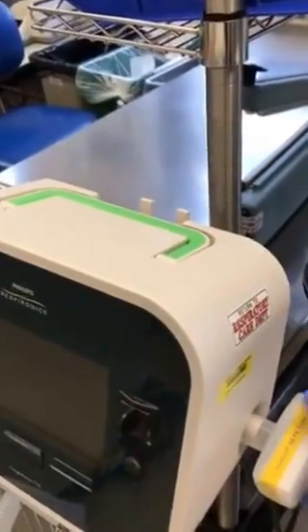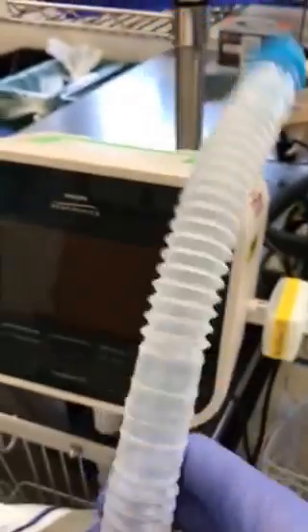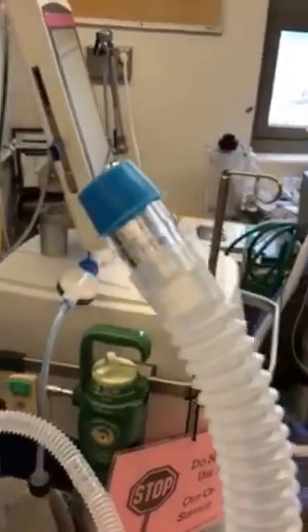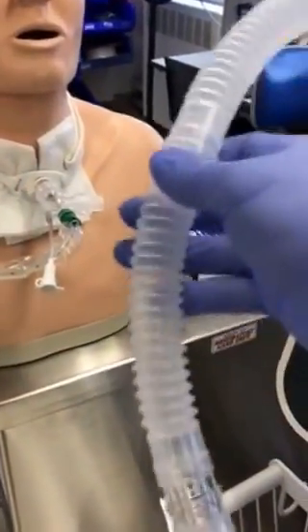You want to make sure the MIE machine always has a HEPA filter attached to it, and tubing not too long but enough. What I like to suggest is adding a 15 millimeter piece, then adding a little bit of length tubing to it, and then another 15 millimeter piece. That way, if the patient has a lot of secretions coming up, you can change out this part only and throw it away, instead of having one long piece where, if that part gets dirty, you have to change it out every time.